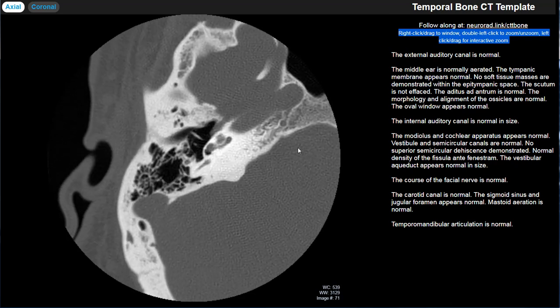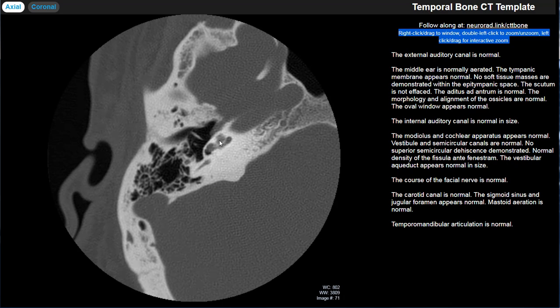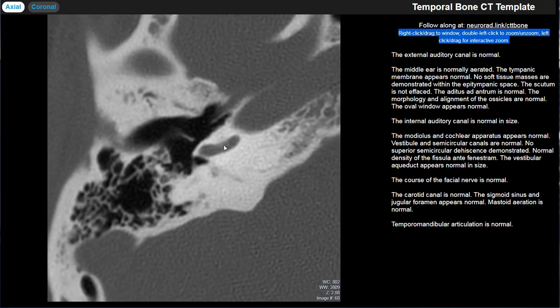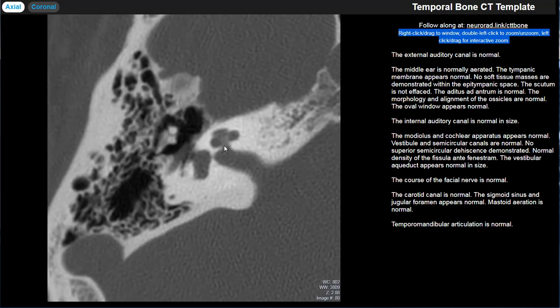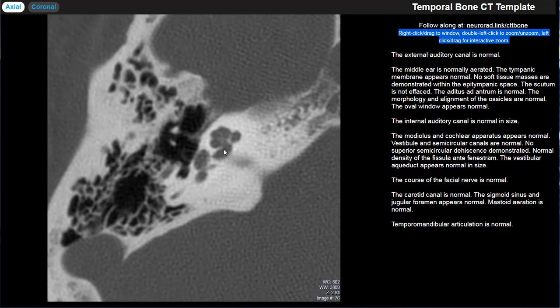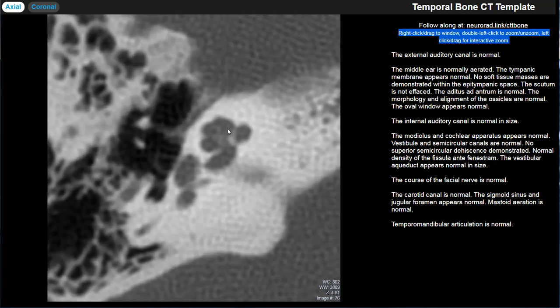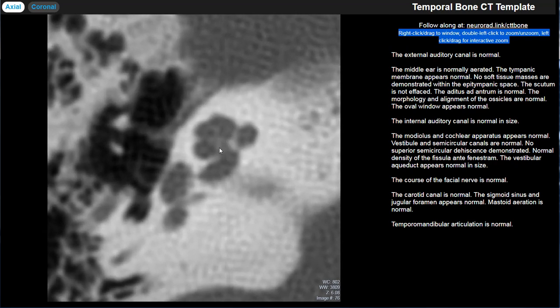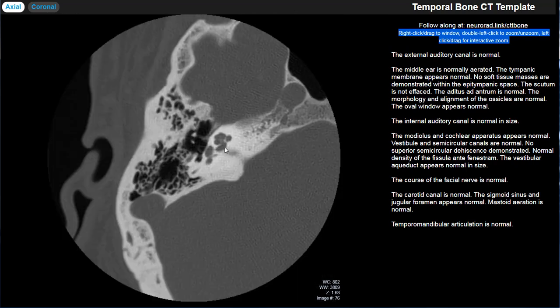If you right click, that allows you to window and level. If you double click, that zooms in a little bit. If you left click and drag, that zooms in even more, and then if you double click, that will reset your view.